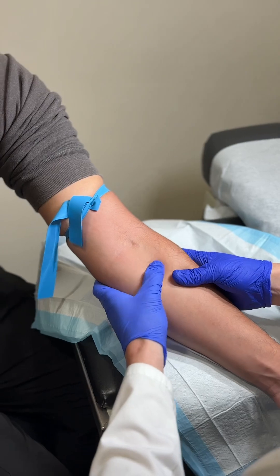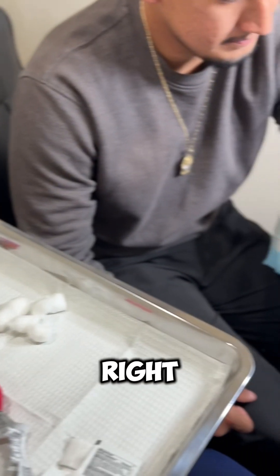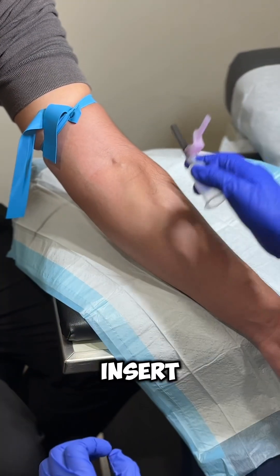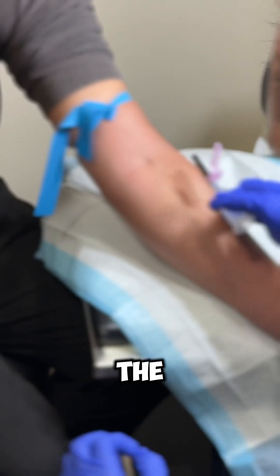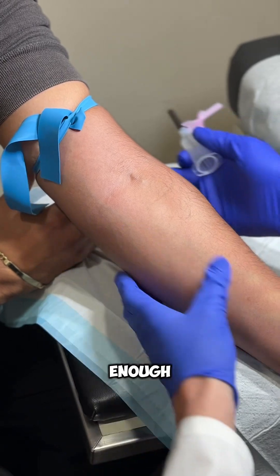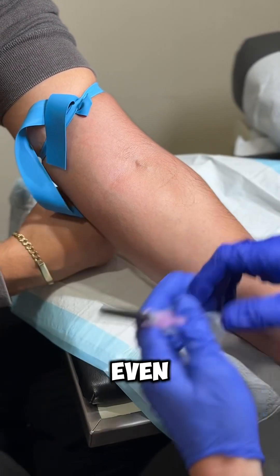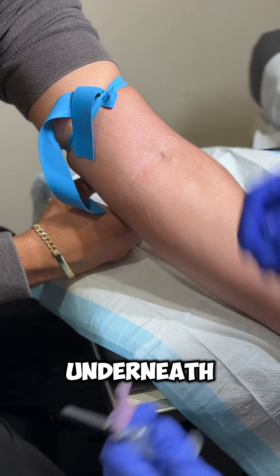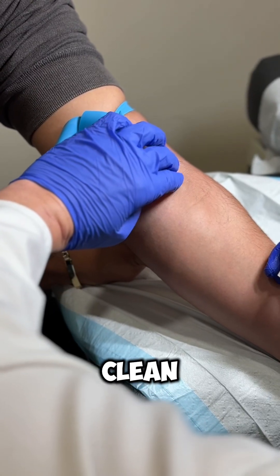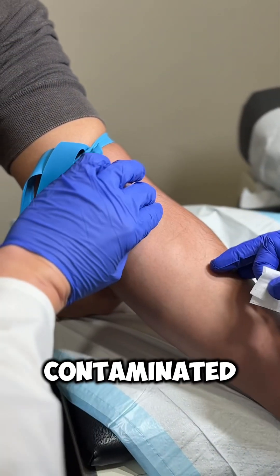I know Carlos's vein goes up there. When you insert, you can actually feel the needle poke through the vein — you feel that tension as you cross it. Straighten up like this — perfect. If you don't have enough support you can always put a pillow underneath. Even though there are lumps, there is a vein underneath. If you touch it again and forget where it's located, you have to re-clean the area.